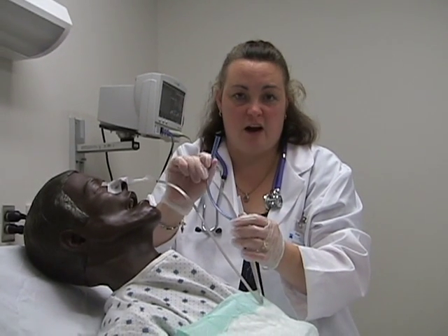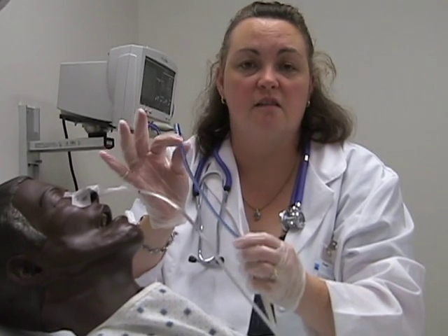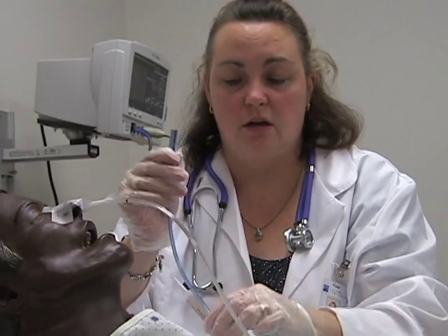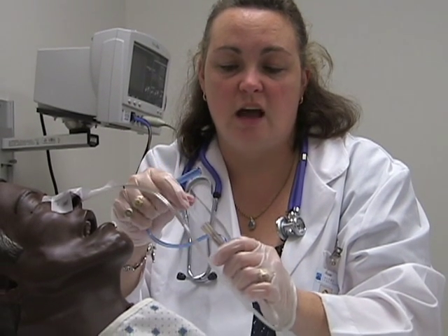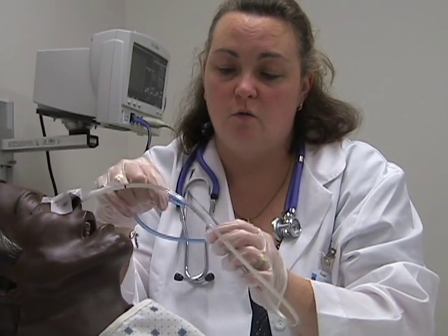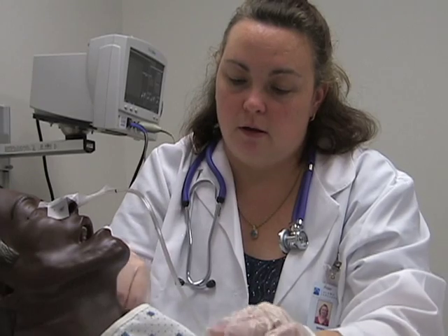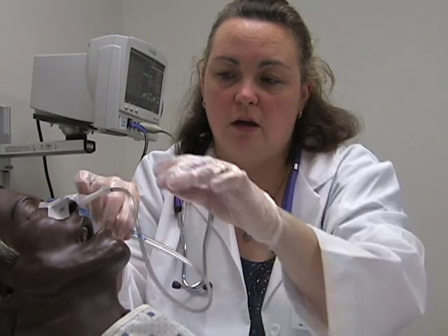The blue vent allows air to vent out during suctioning. This port does not have medications going through it, and usually an anti-reflux adapter is placed on top so gastric contents do not come out. If the patient is on medications, intermittent feedings, or not connected to suction continuously, you can use the adapter to close the loop, and the patient can be moved for transport or procedures. You can also attach the tube to the gown with tape and a safety pin.